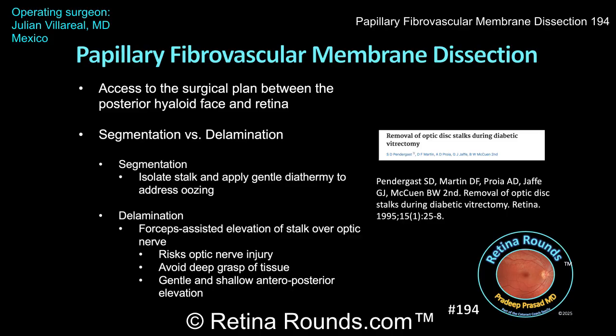If forceps-assisted elevation of fibrovascular membranes is performed over the optic nerve, there are several precautions one can take. First, you want to avoid grasping too deeply, as that can result in direct injury to the optic nerve. Instead, aim for just a shallow purchase of the membrane with a very gentle, limited anteroposterior elevation — just enough to loosen the adhesions over the disc. Once that plane has been identified or slightly opened, you can then perform the majority of the dissection more safely using the vitreous cutter rather than continuing to induce traction with the forceps.